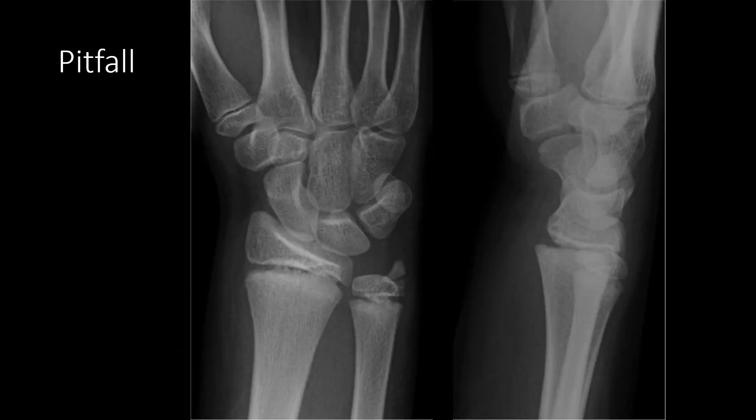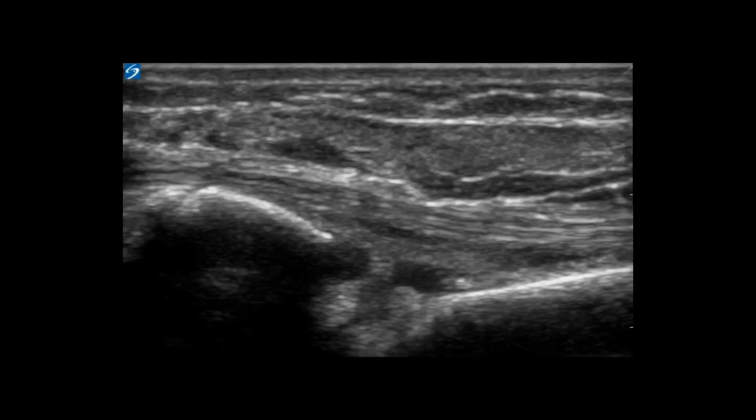Please keep in mind that growth plates can have a similar appearance depending on the nature of the fracture, and you need to be aware of the location of growth plates so as not to confuse them with a fracture. As an aside, the same scanning technique could be utilized to perform a hematoma block prior to reducing the fracture.